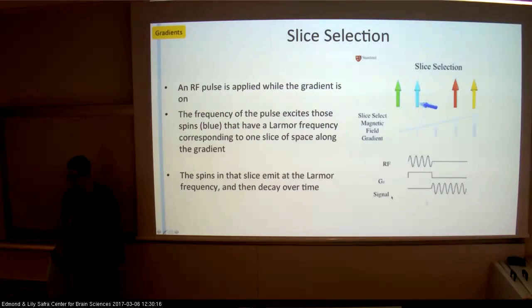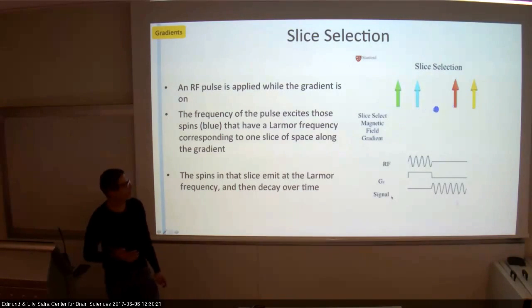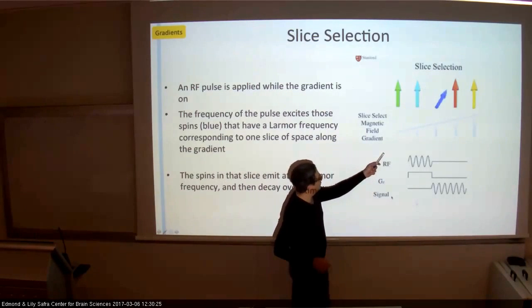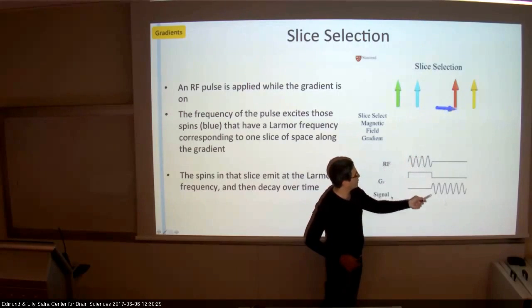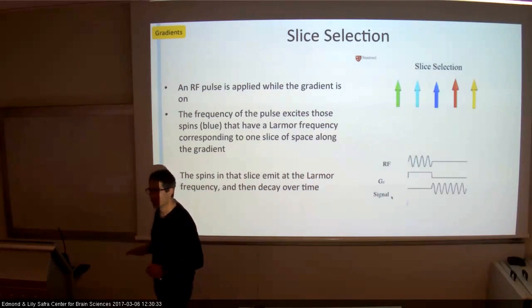Just turn a gradient, there is a specific frequency. Okay, so we have a gradient, so that means my RF frequency will work only on one location, and so I'm getting the signal only from there. Just a very simple metaphor here.